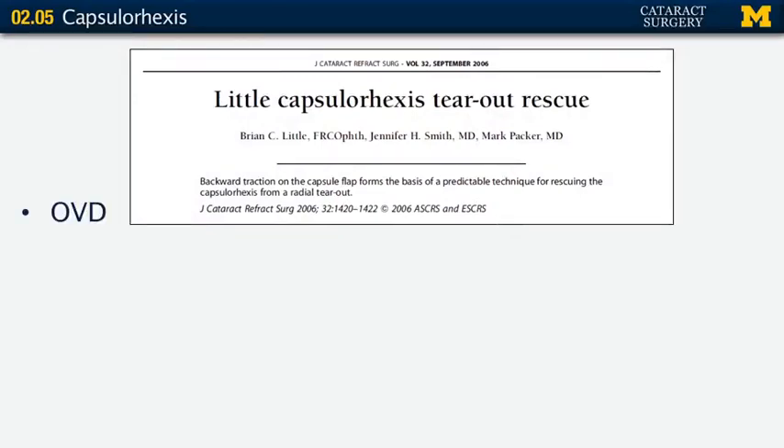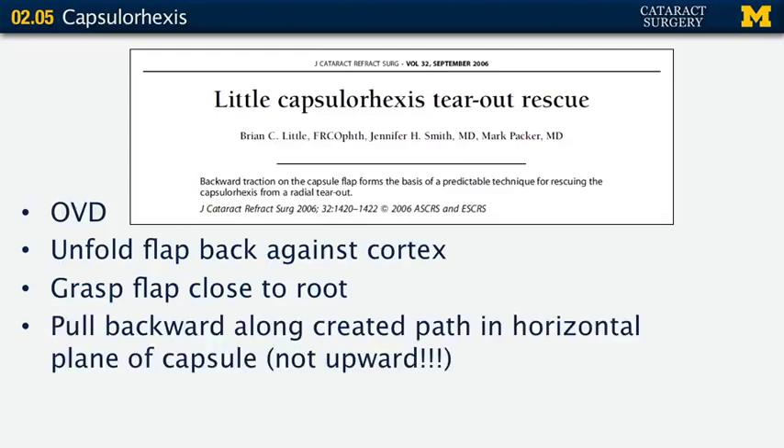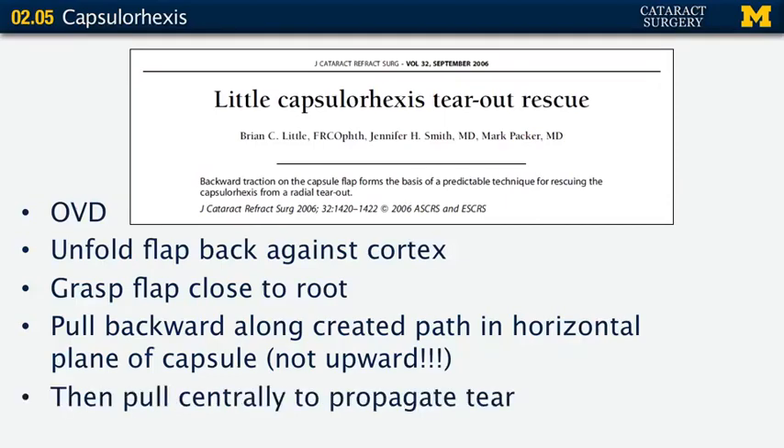Once you recognize something is about to happen and you're going peripheral — stop. Put in viscoelastic and evaluate the situation. Then take the flap you've created and fold it back against the cortex right where it came from. Grasp the flap really close to the root, close to where the tear is originating. Pull backward along the path that the tear was going — keep flat, down next to your cortex — then pull centrally toward the center of the lens, and that will propagate the tear inward.